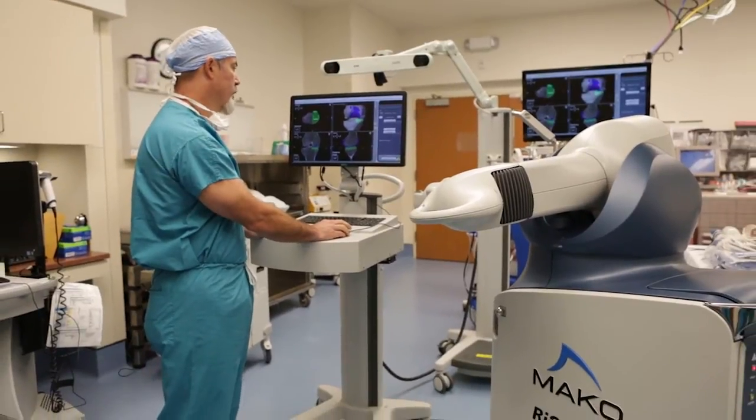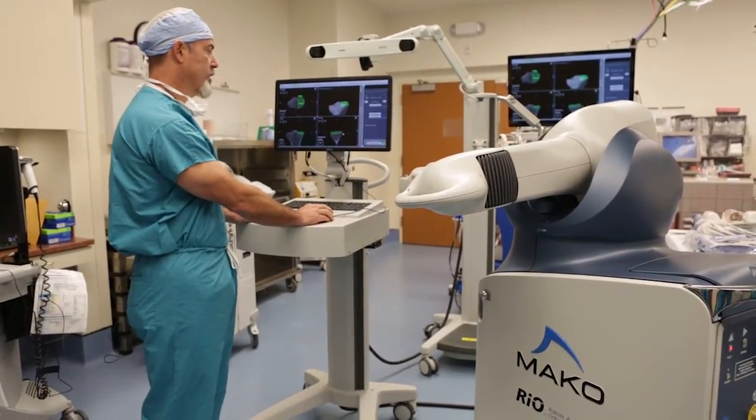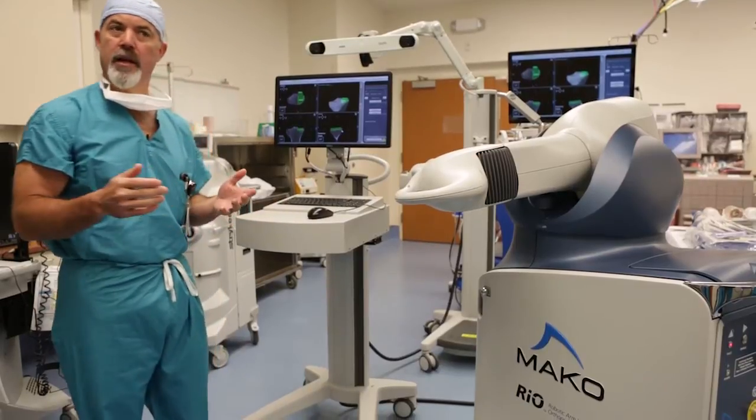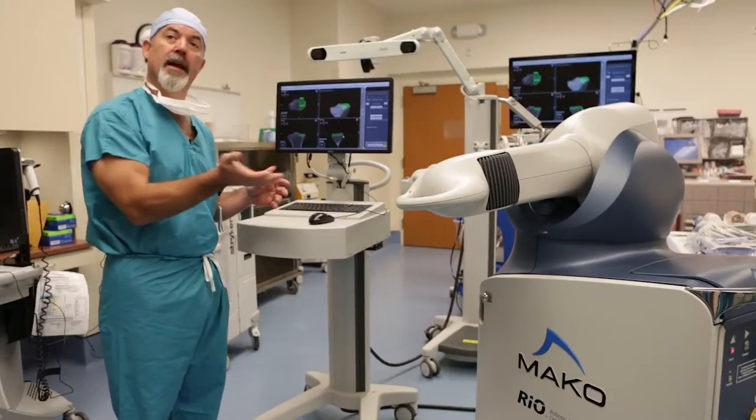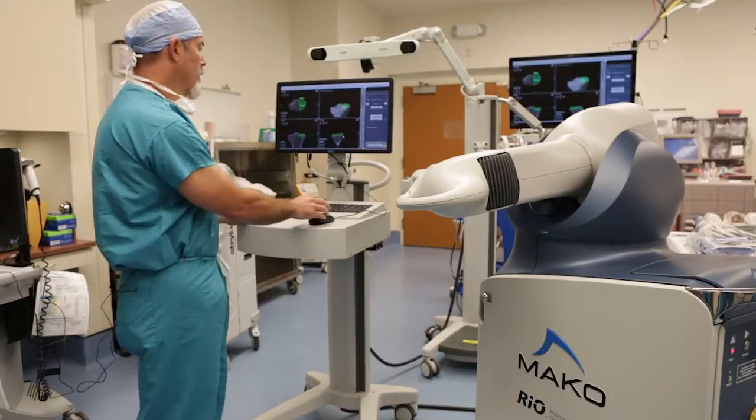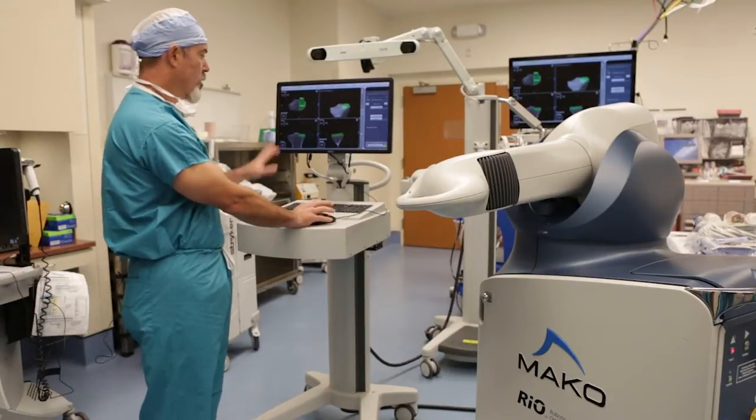When I start my planning, I start with the simplest bone to plan, which is the tibia. It's the simplest because it's essentially a platform — there's not much curvature to it, as opposed to the thigh bone where the end of the femur is quite curved.